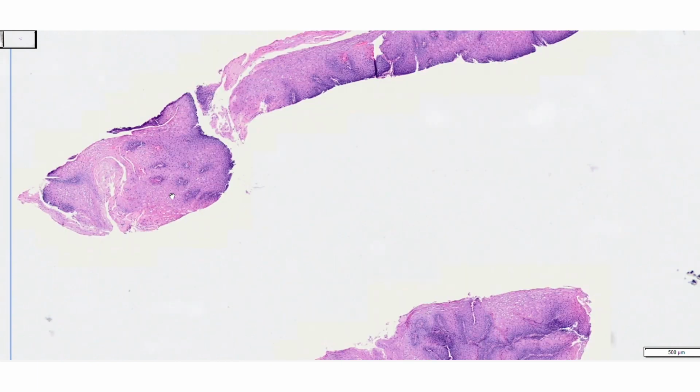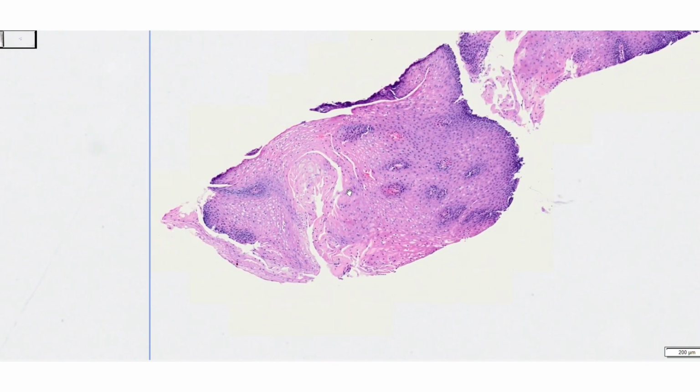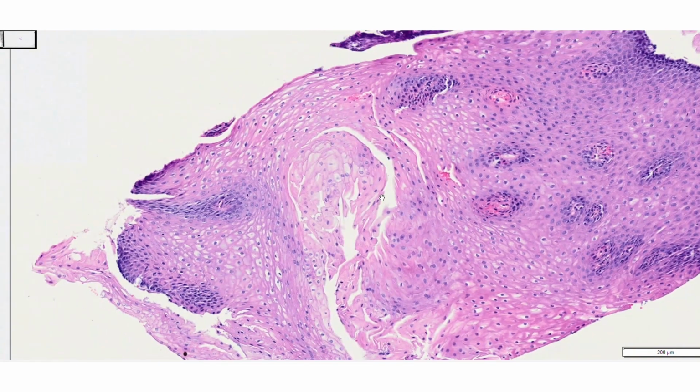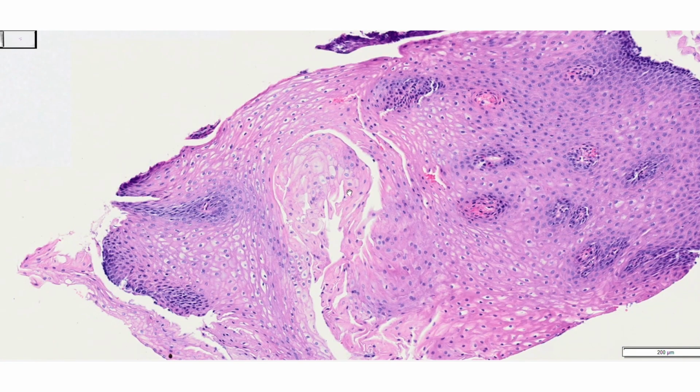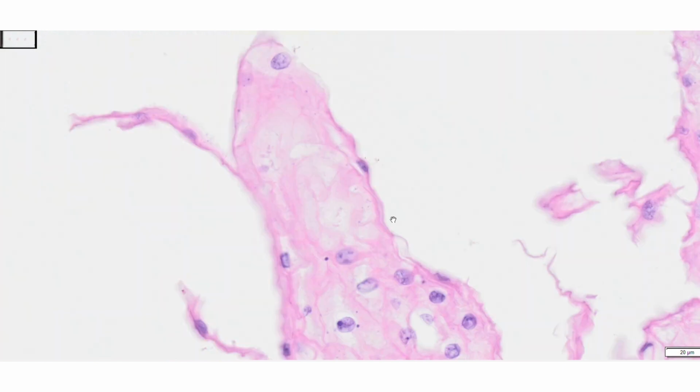And this is another cut of the distal esophagus, and I just want to also point out that this is probably one of those larva cysts. If you remember, when we looked at the different slices of the larva cyst. Okay, remember, for example, here, where we can see this clearly, this should be a diagnostic image here.